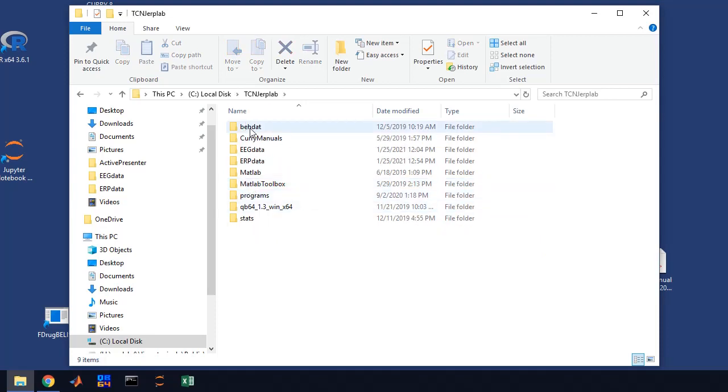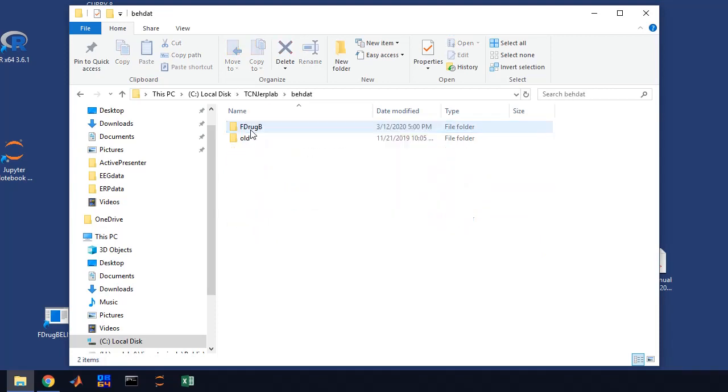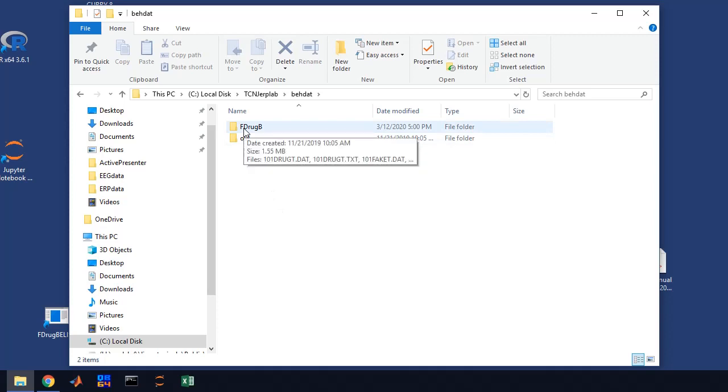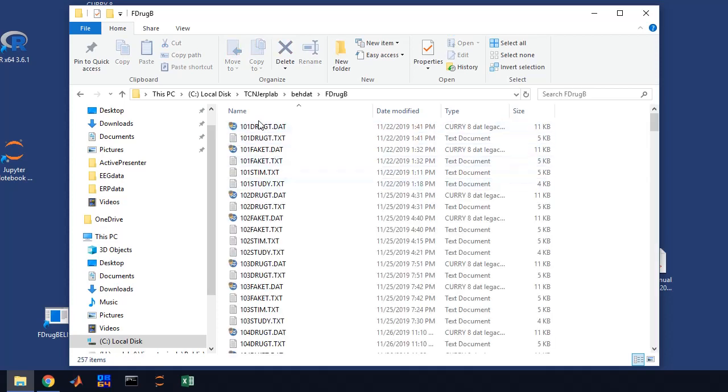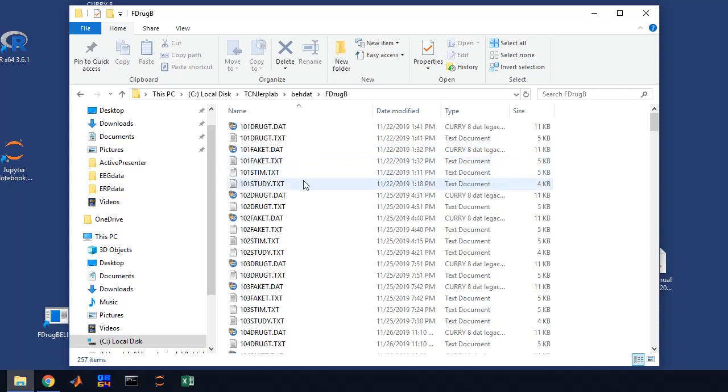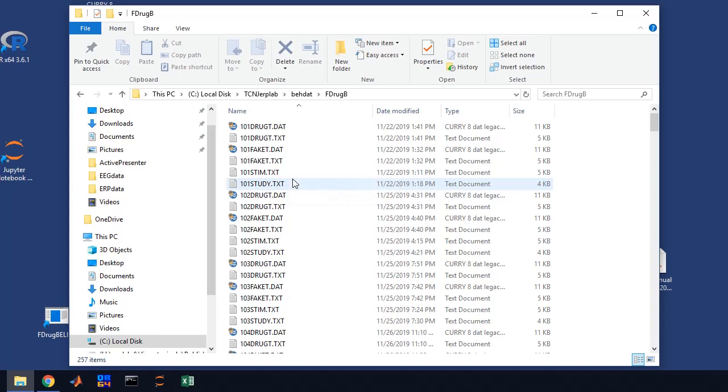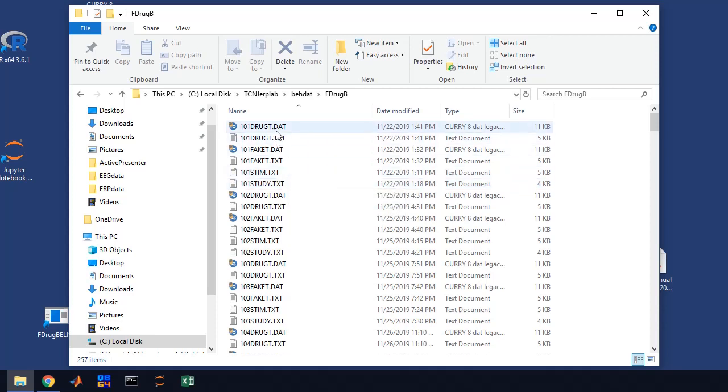If we open it up you'll see that we have a behavioral data folder and each study has its own folder. The study that I'll be processing here is called F drug B. If we open this up, you see that subject 101 has some data files here.